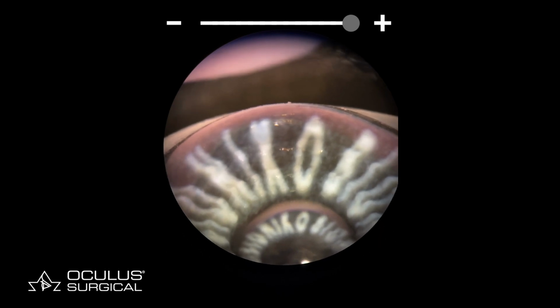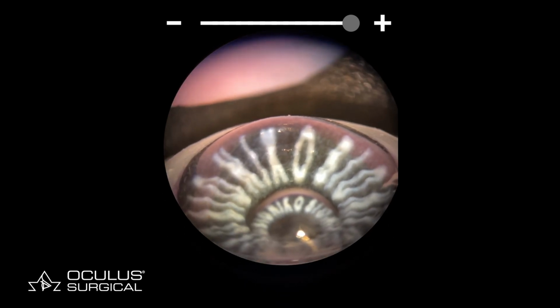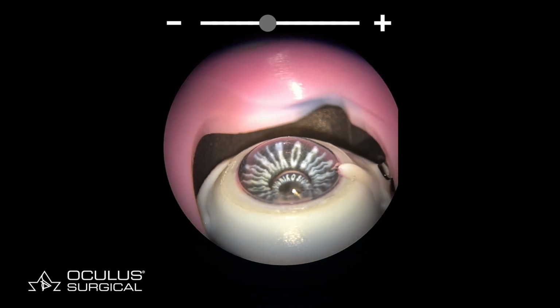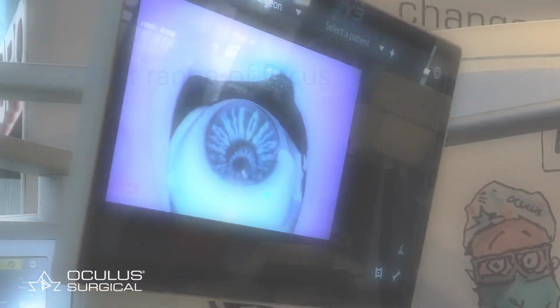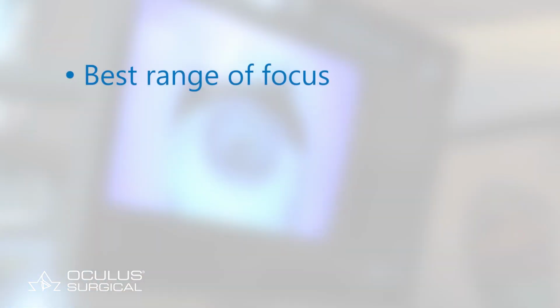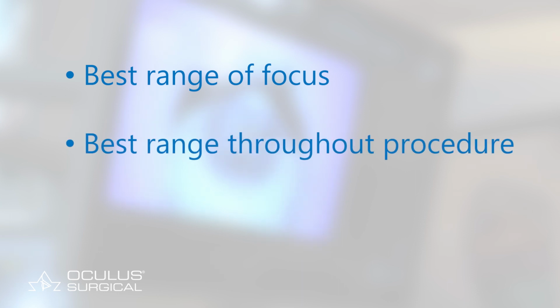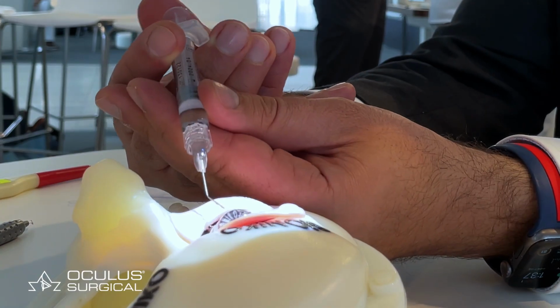Once we're all the way zoomed in, the next step is to focus in on the nasal iris, establish the best focus in this zoomed in position. Once we've done that, we can zoom all the way back out before we start our MIGS procedure and before we bring the gonio prism down onto the surface of the eye. This gives the surgeon the best range of focus throughout the procedure, and also the best stereo throughout the procedure as well. So next, visualize the anterior chamber angle.